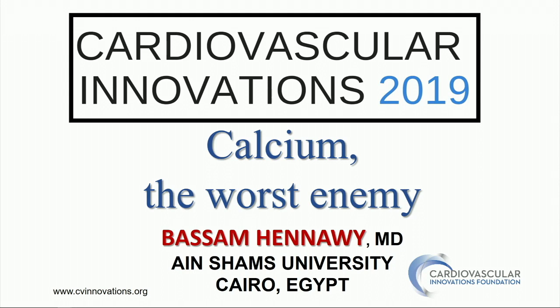Our case today is all about calcium in coronary intervention, and it was a case with a disastrous complication, and we'll see what happened. I chose this name because of the feeling I felt while we were operating on this case. Calcium at most times will be the worst enemy for coronary interventionists.